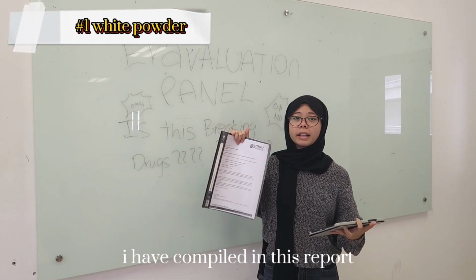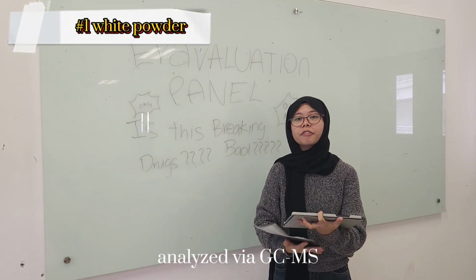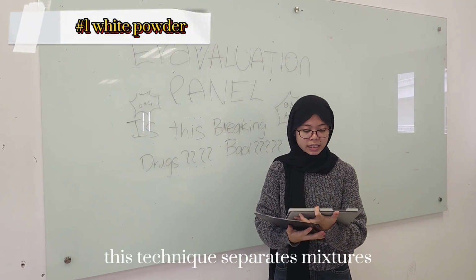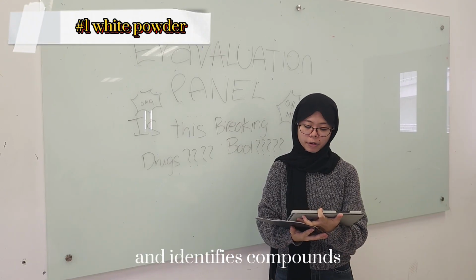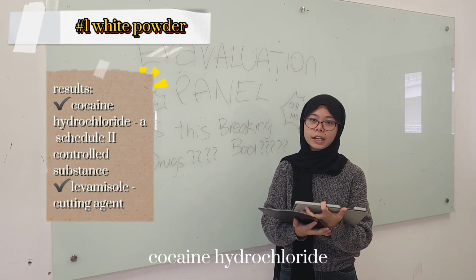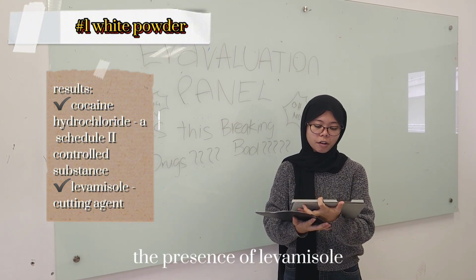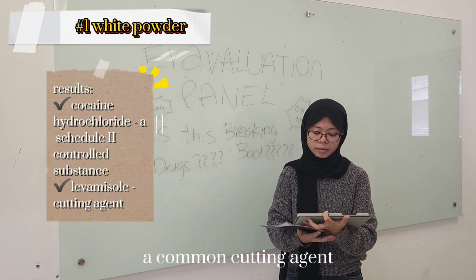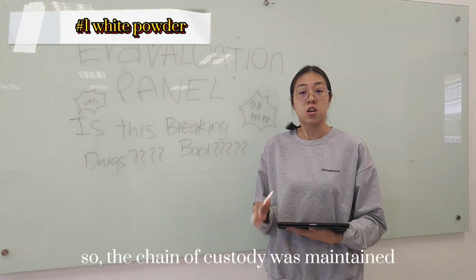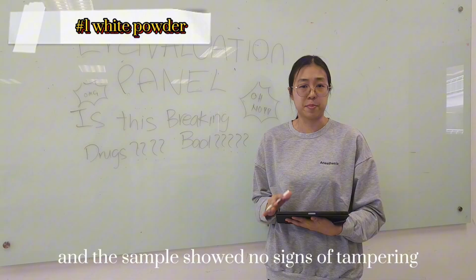As I have compiled in this report, bag A contained white powder analyzed via gas chromatography mass spectrometry. This technique separates mixtures and identifies compounds by their mass spectra. Results confirmed that the powder was cocaine hydrochloride, a Schedule II controlled substance. The presence of levamisole, a common cutting agent, was also detected. The chain of custody was maintained, and there is no sign of tampering.